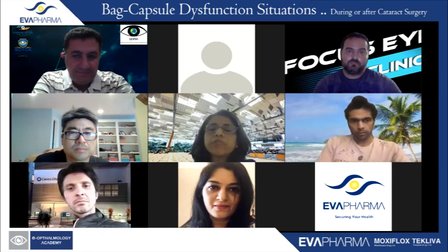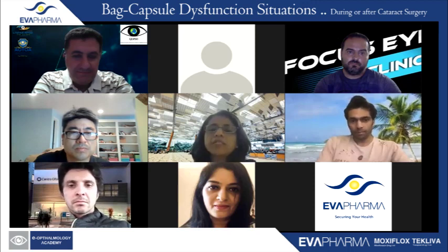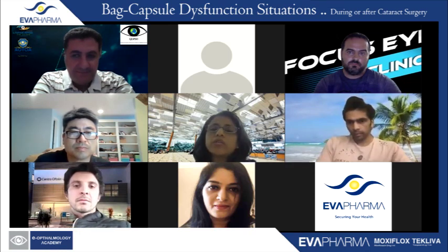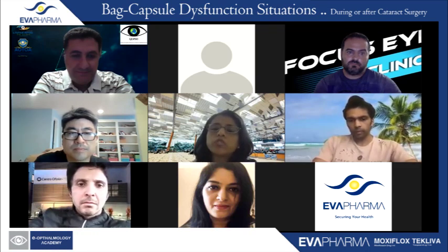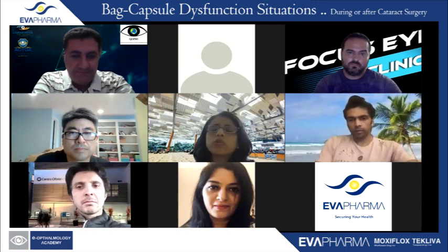That's basically done by putting in an anterior chamber maintainer. In both my cases, I had an anterior chamber maintainer inside the eye, and that prevents hypotony from happening. If you don't have hypotony, you're not likely to get any bleeding. Your entries are into the anterior segment, not the posterior segment. So you may have a little bit of bleeding, but it's not massive.